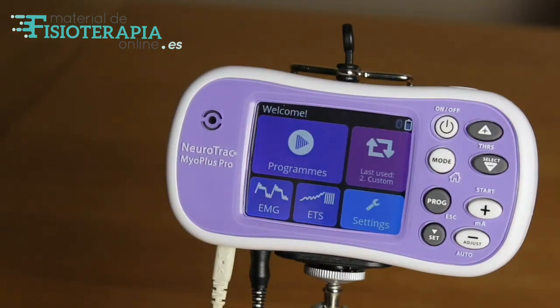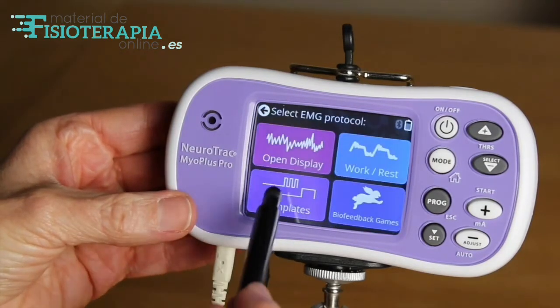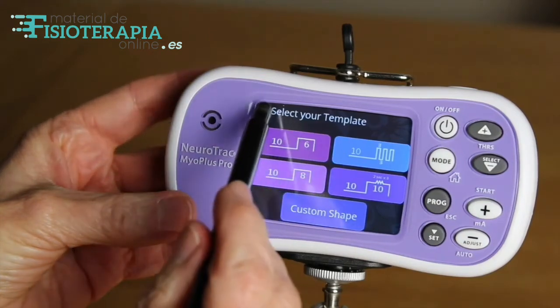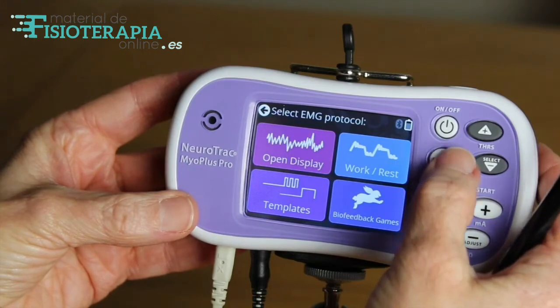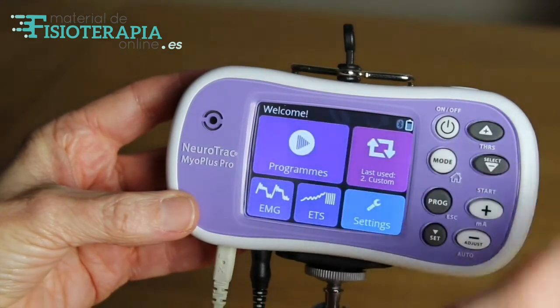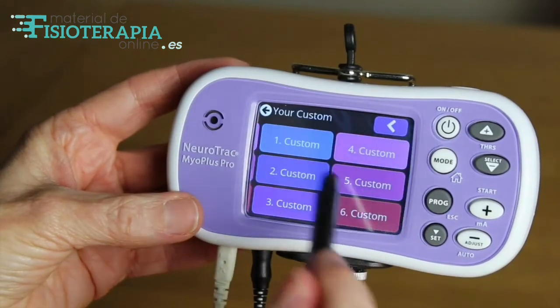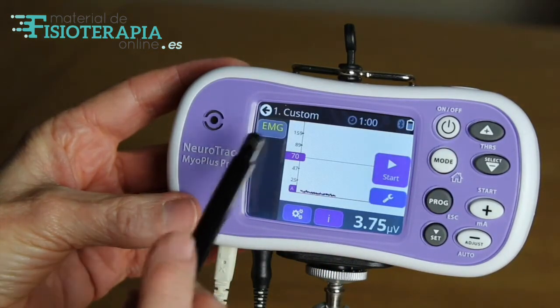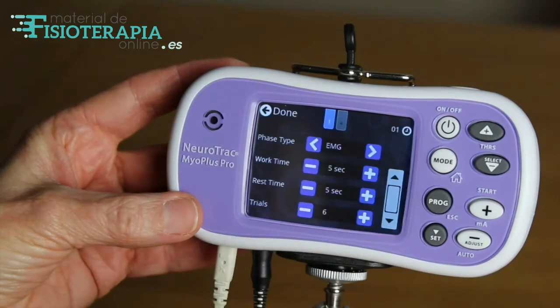After completing the work-rest assessment, you can either go on to use some of the preset biofeedback programs shown here, or you can set up your own EMG biofeedback program by going to the welcome screen, opening the programs, and moving to custom. Here you can see I've set up custom one to start with EMG, and you can see the specific settings I've chosen.